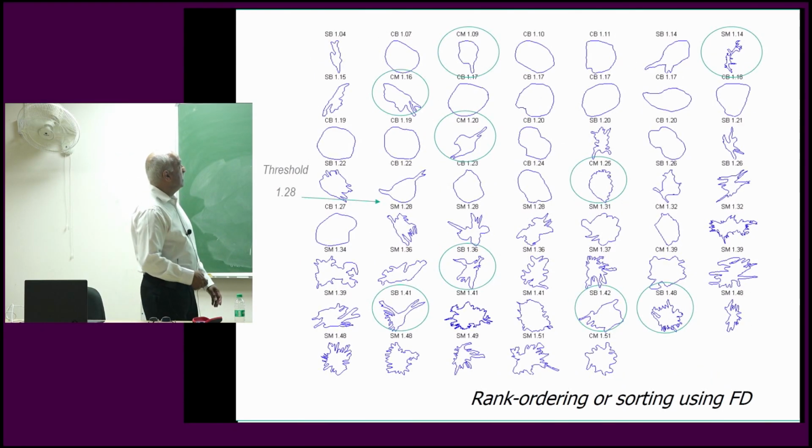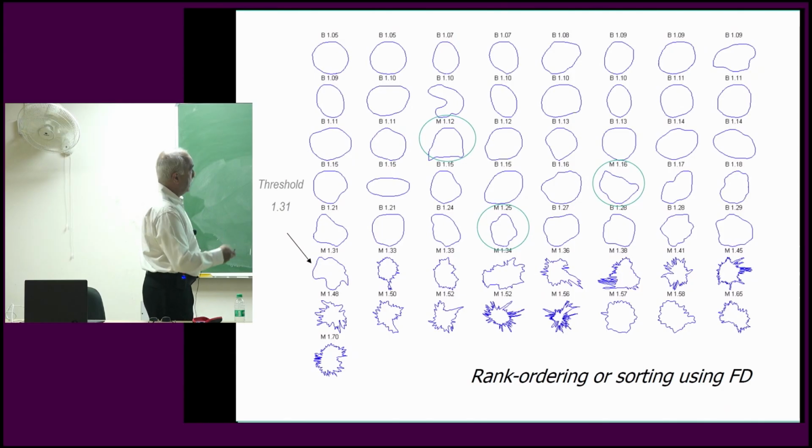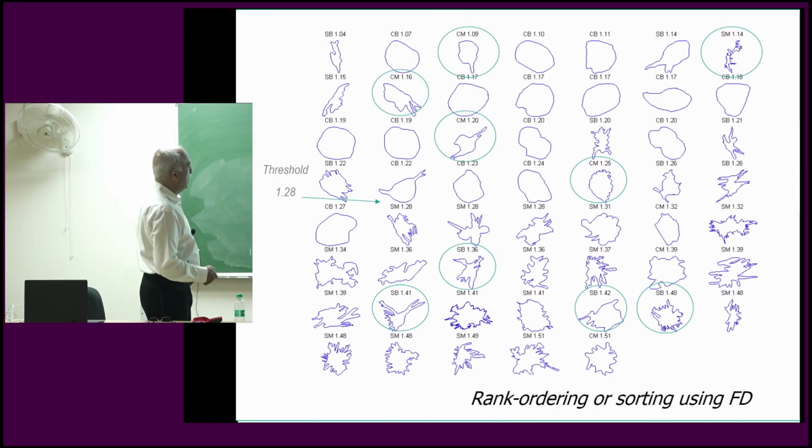Another data set. This is the MIAS data set. This is our data set from the Foothills Hospital in Calgary. This is from the MIAS data set. That is the very first one, spiculated benign, but it still is only 1.04. So these are going there, and let's say the threshold is 1.28. We have several misclassification examples here, going to 1.5.